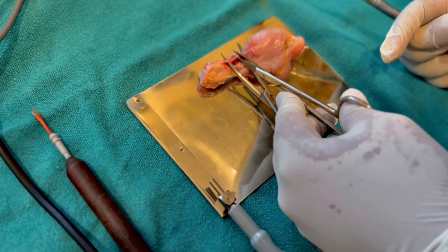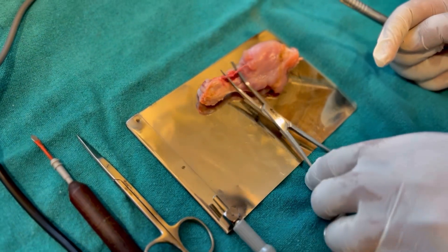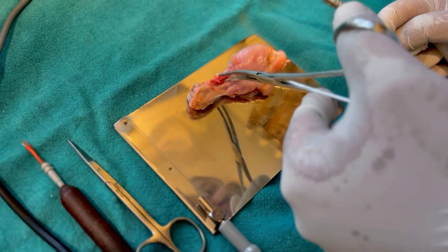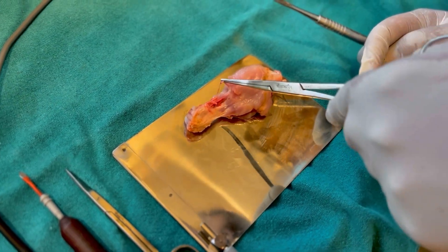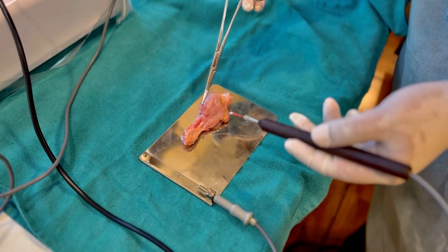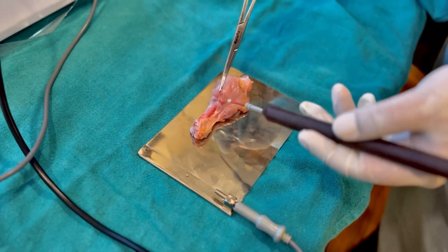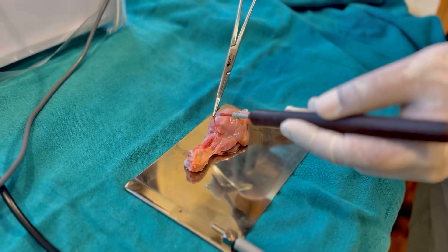We are going to injure this vessel — it's not bleeding yet, but what we have to do is now crush it. We have crushed the vessel, and now we have to cauterize it. In the cut mode only, I'll just start cauterizing it. This is how you are able to cauterize a bleeding vessel.